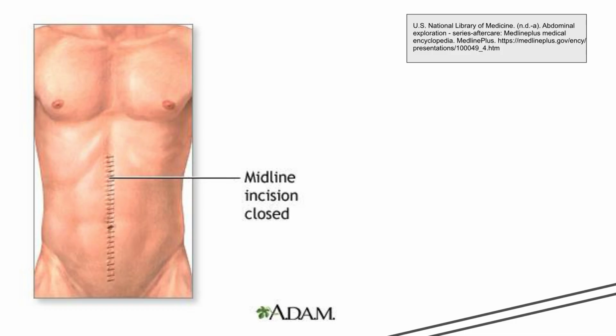Conventional gauze or 4x4s are used upon skin closure with a bandage, skin strips, and tapes. The skin may also be closed using Dermabond, a skin sealant, and sometimes no dressing at all is used to allow for open wound healing.